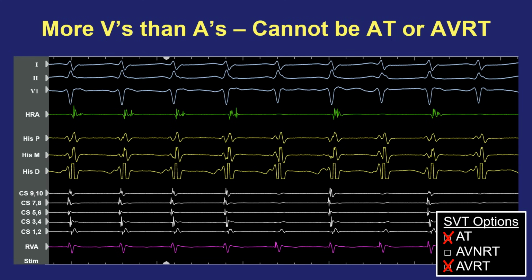We didn't get into it in this presentation so much, but this could be a junctional tachycardia, and there are maneuvers that can be used to differentiate AVNRT from junctional tach. This was AVNRT that happened to be missing some atrial events, and we were easily able to rule out 2 of the 3 possibilities and moved forward toward the diagnosis because of this spontaneous observation.